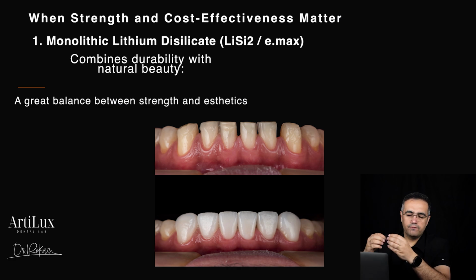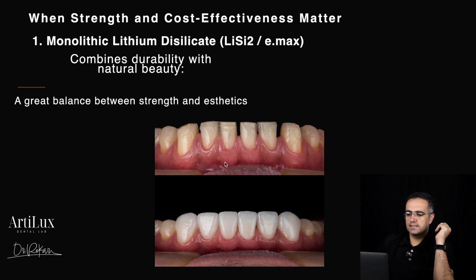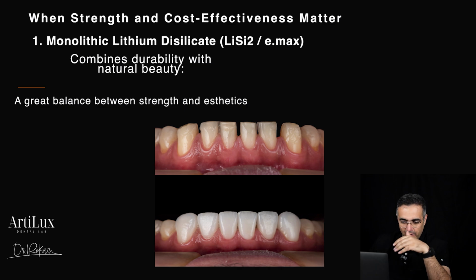For which cases am I using this material? Especially when we have, like in this case, lower veneers that are very minimally prepared and there is no space to do a layering, so it would be very difficult. And especially when the patient asks for a change of color. The patient asks to do the veneers for the lower fours, but it is still in process. I finished this case one year ago, but the patient has not come back to do veneers for the lower fours.